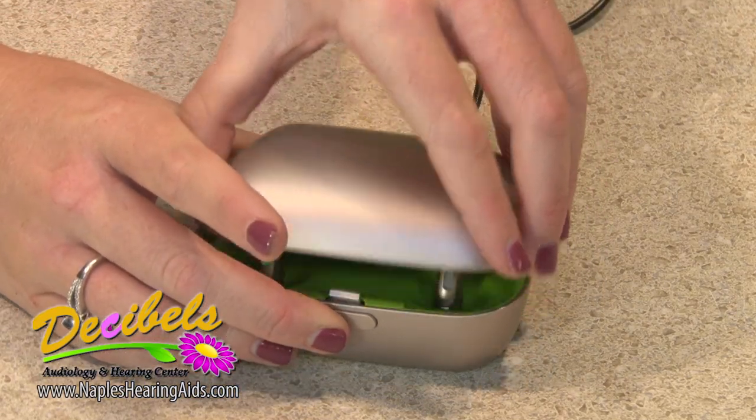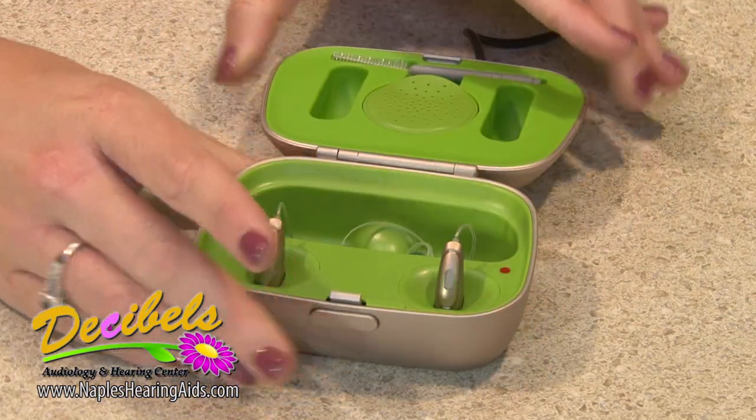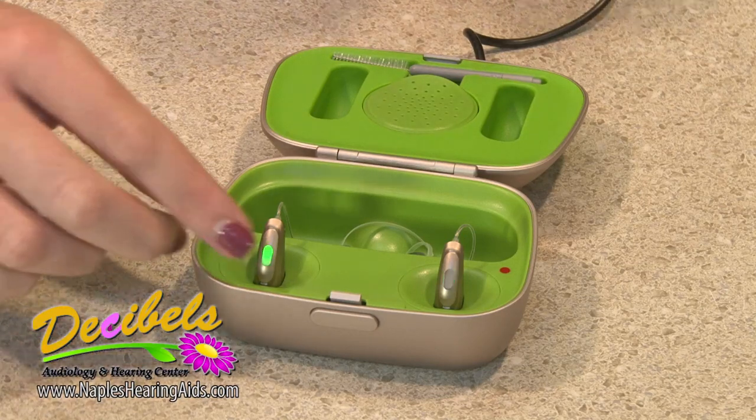Open the case to take them out. The green lights on the devices should now be solid. This means that they are fully charged.